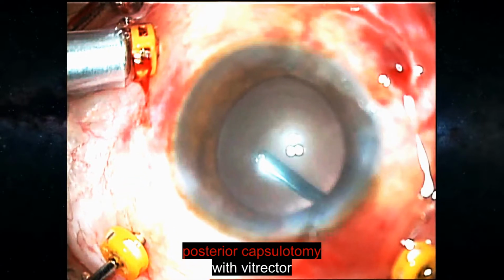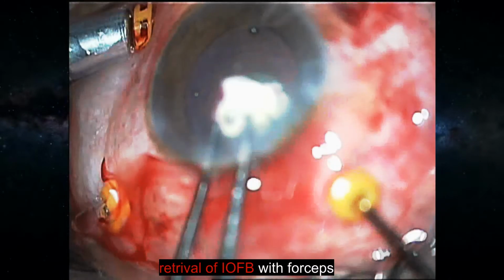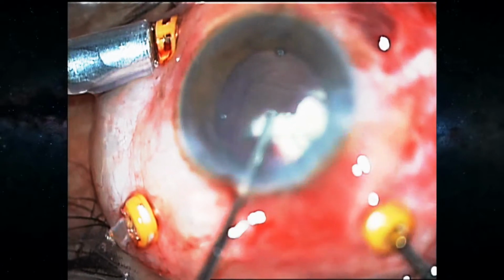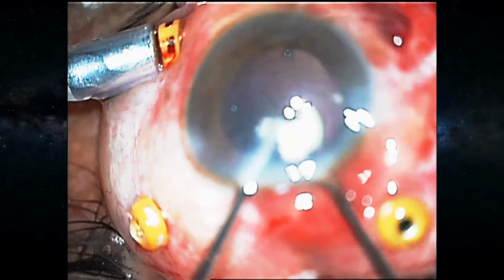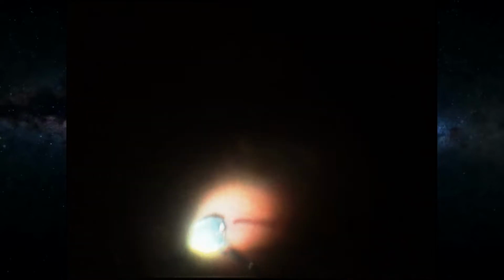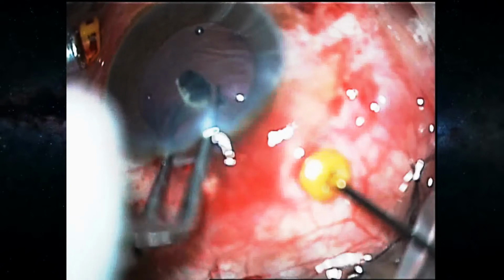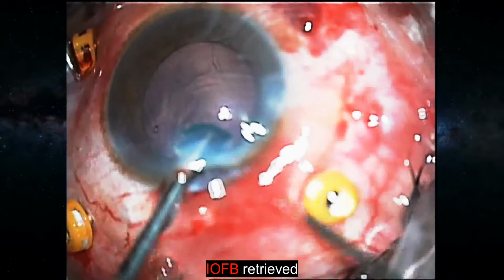Posterior capsulotomy and enlargement of the corneal wound was performed to remove the foreign body through the limbus by the handshake technique. While grasping with the McPherson, the foreign body separated from its fibrous covering. Despite the attempt to prevent it from falling, the foreign body slipped. The impact was cushioned by the PFCL bubble and the retrieval was attempted again. This time it was successfully retrieved.